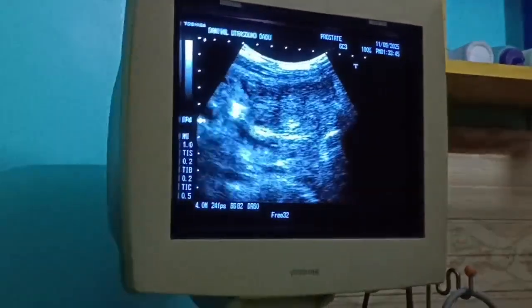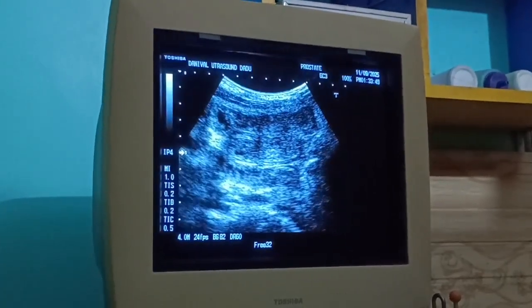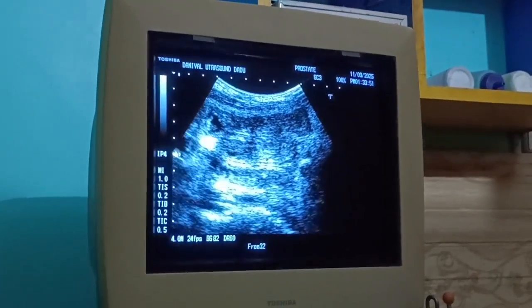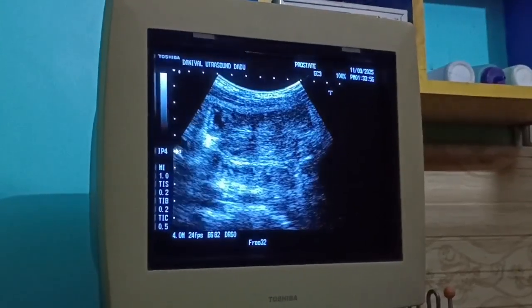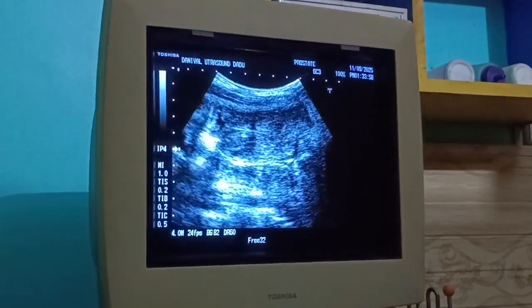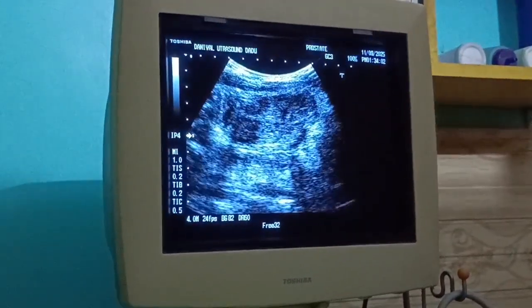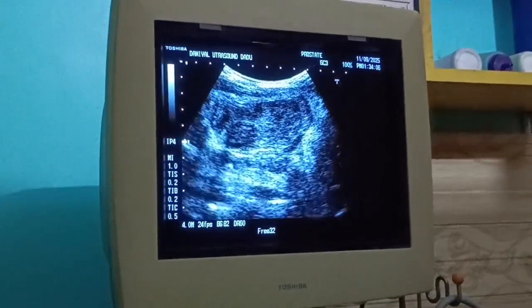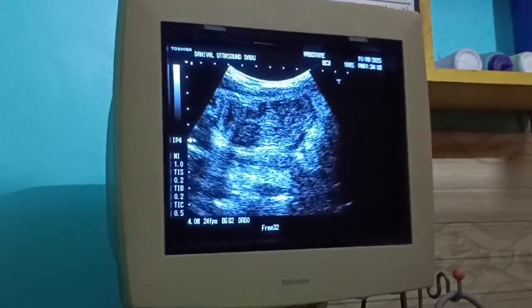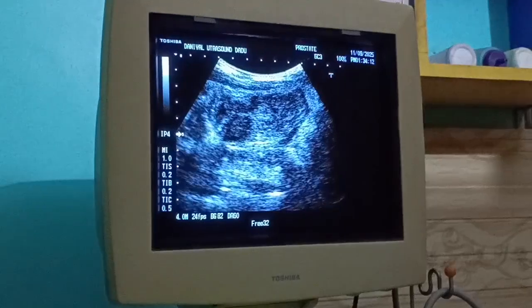what are the reasons of gut wall thickening. There are too many reasons, but inflammatory or neoplastic, as well as ischemic bowel disease and other causes like edema due to hypoalbuminemia or radiation enteritis or colitis may be considered initially, but with the other investigations we can come to know the exact cause.